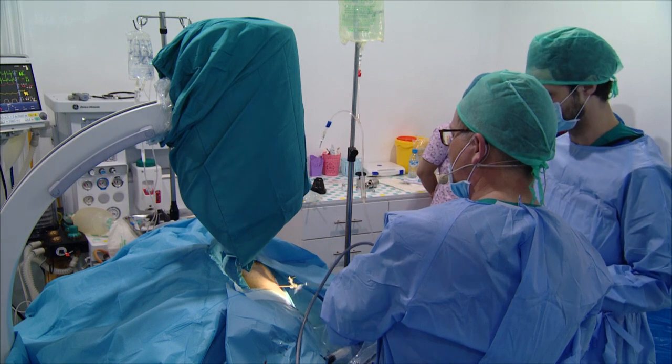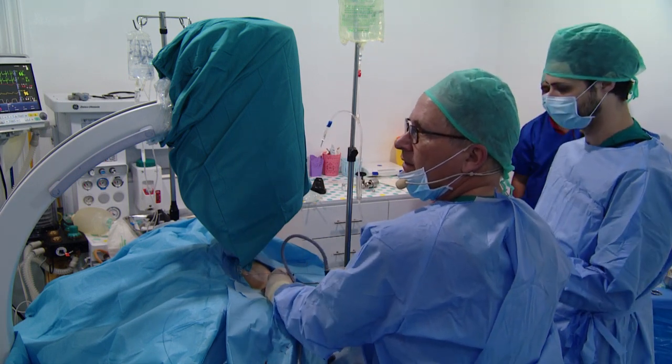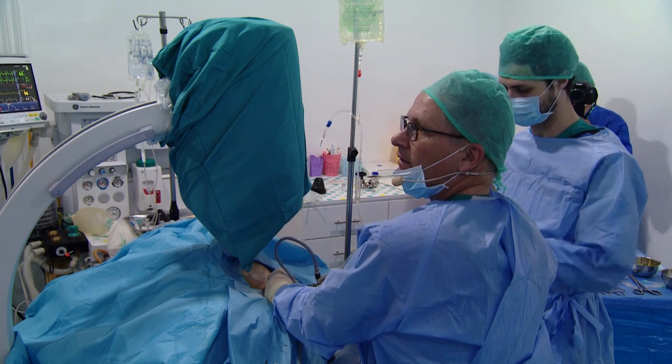Der zweite Stein ist noch drin. Der zweite ist noch drin, der ist etwas oberhalb.